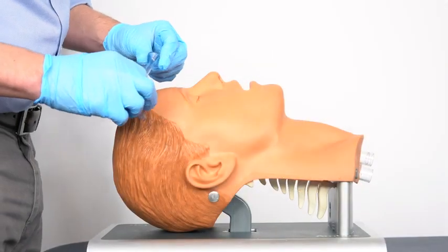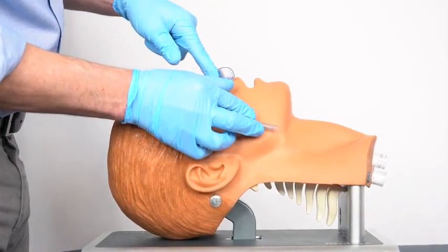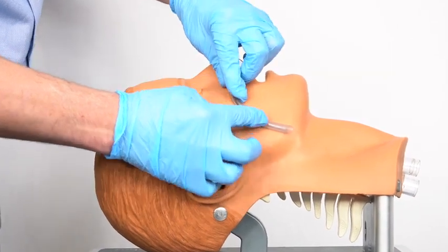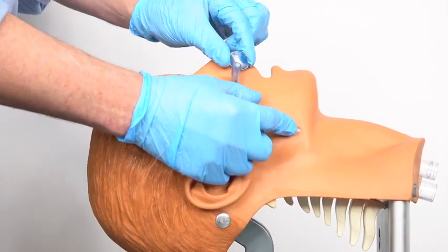Once the nasopharyngeal airway is in position, it's going to sit roughly like this, with the flange at the nostril, the first part of the tube going along the floor of the nasal cavity and then gently curving around so the tip is sitting in the back of the oropharynx.